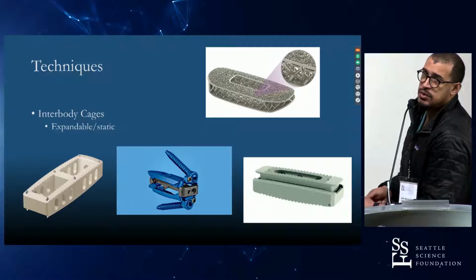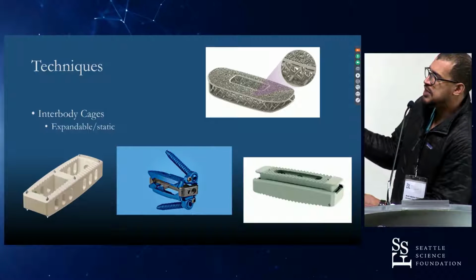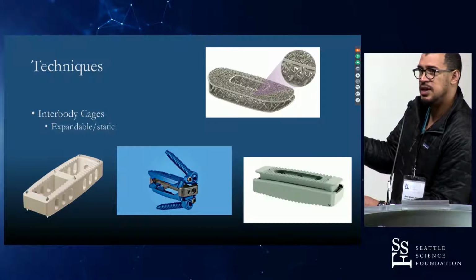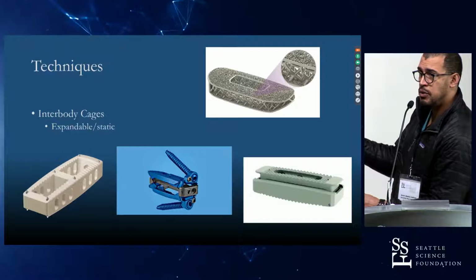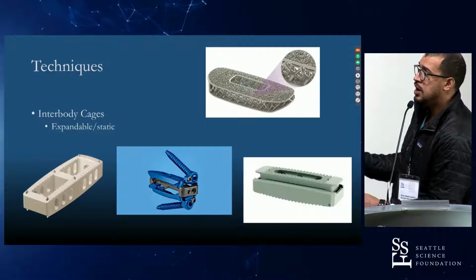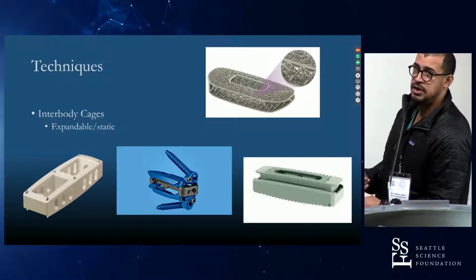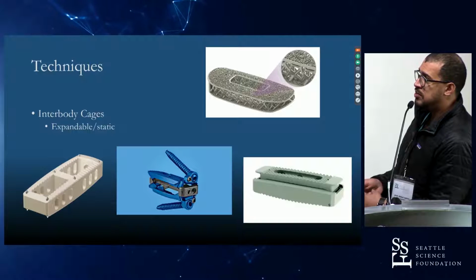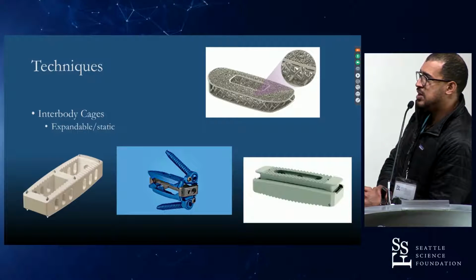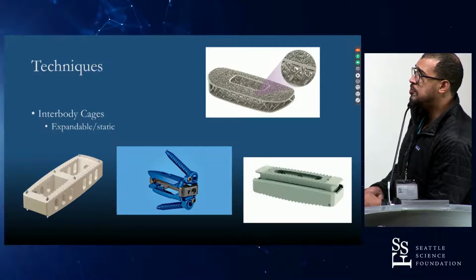And again, you have to really plan ahead, because if for some reason you can't get a cage in because of that, you looked at a high iliac crest, you're planning on doing 3-4 and 4-5, you're only going to get that much from the single level, and you have to know that your plan might change at that point. Obviously these are all complex things we do in spine surgery, but something you definitely want to be aware of as well.